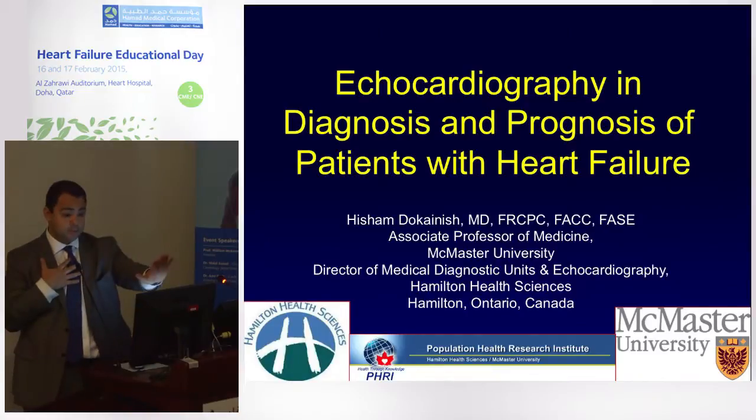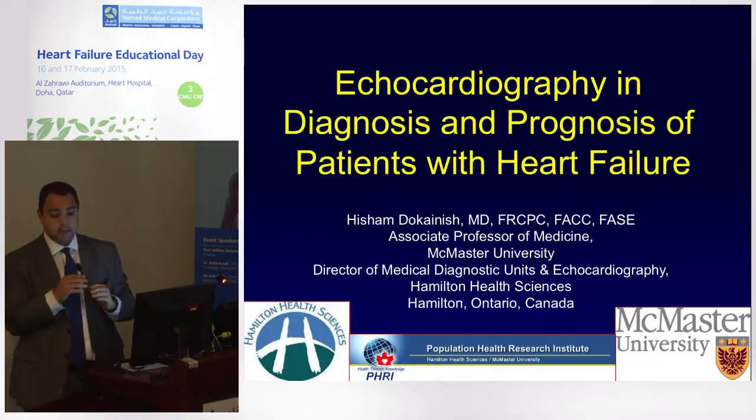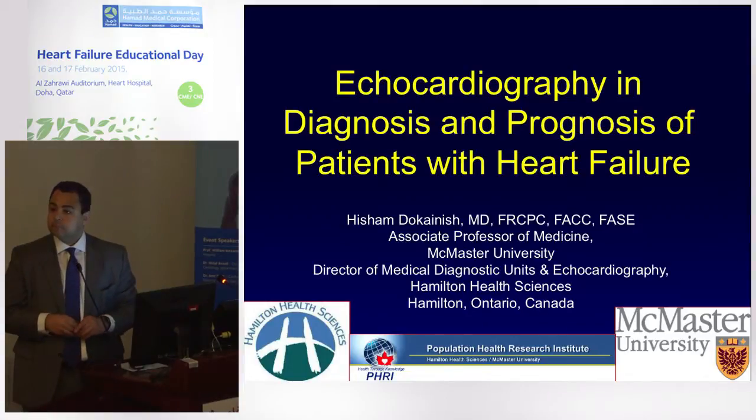And I'm not an HCM expert, Dr. McKenna is. So if you have questions on the genetics, please refer to Professor McKenna. But this is a simplistic echocardiographer's understanding of how it can be incorporated. So clinically, yes, global longitudinal strain. Twist untwist is still a research modality, but untwist seems to be fundamental to LV filling, especially in preserved EF. Any other questions? Yes, sir.